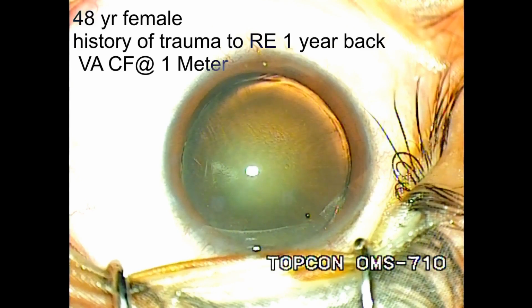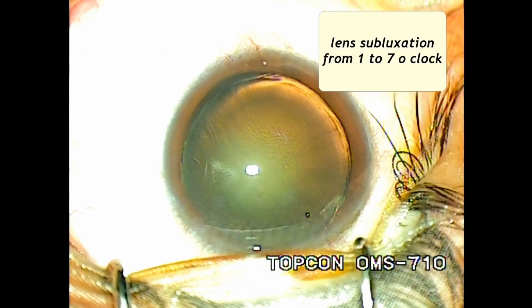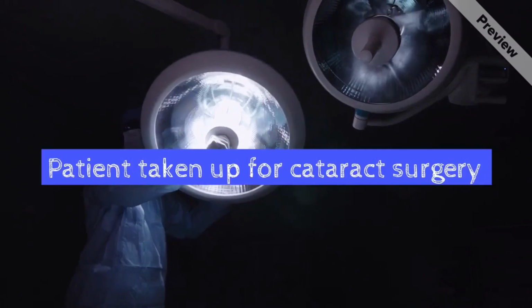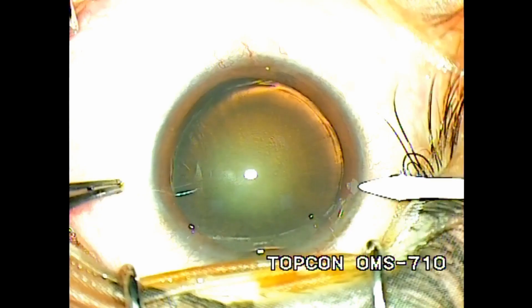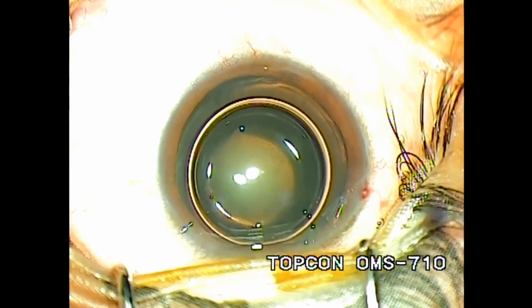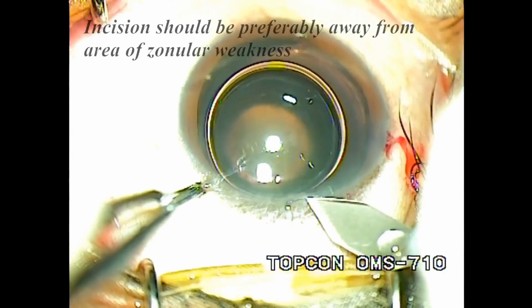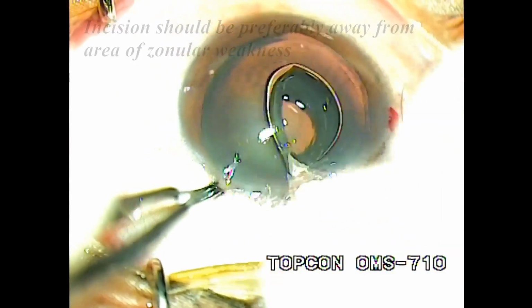Here, we have a 48-year-old female with a history of trauma to the right eye 1 year back, with a visual acuity of counting fingers at 1 meter. On examination, there is lens subluxation approximately from 1 o'clock to 7 o'clock position with no evidence of phacodonesis or vitreous disturbance. The patient is counseled regarding complications anticipated and taken up for the surgery, IOL implantation with Ciani ring for capsular support. A side port is made and the anterior capsule is stained. A clear corneal incision is made away from the area of zonular weakness.